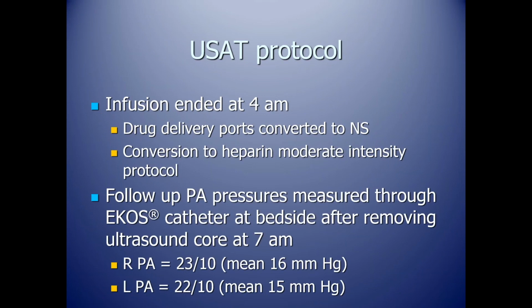In the morning, when our first technologist comes in, they will go to the bedside, and I'll tell you how we got there in a second. But they'll go to the bedside, they will remove the microsonic cores, they will cap off both the drug and the coolant delivery ports, and then they'll hook the central lumen of the catheter up to a pressure transducer.